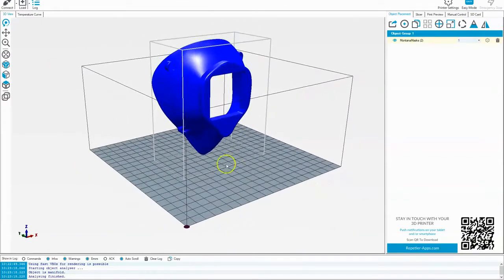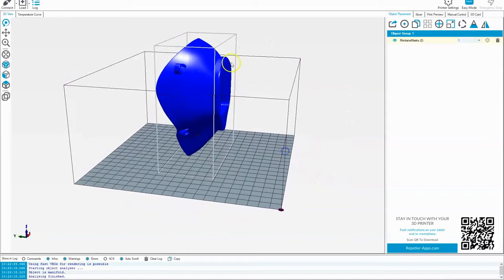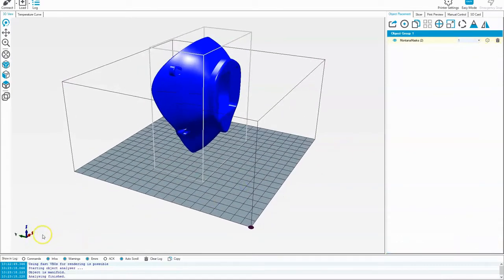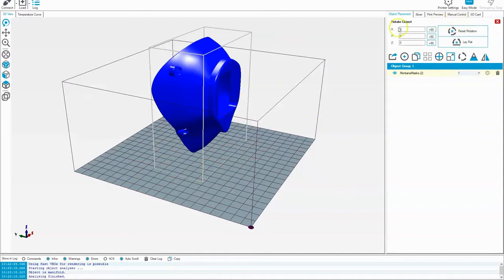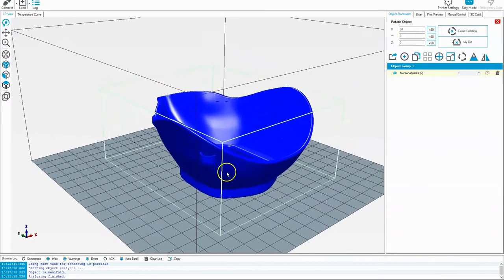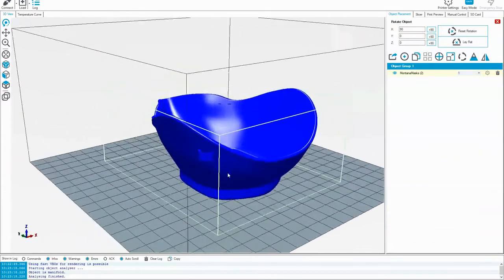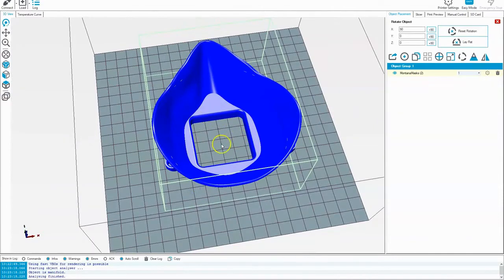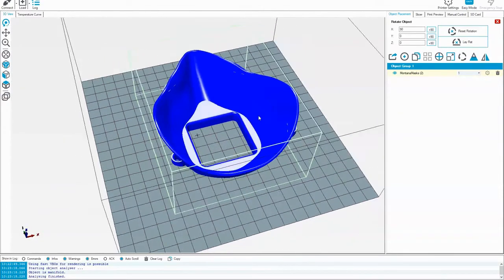I want to rotate this mask so the flat portion of the mask is actually on the base itself. Looking at the XYZ, it looks like the X is the axis I need to rotate around. So I'm going to go to the Rotate Object tab, find the X axis, and rotate it by 90 degrees. That brings us so that it is sitting flat on my print build plate. At this point, I'm not going to scale anything because I want the filter to fit just as intended.